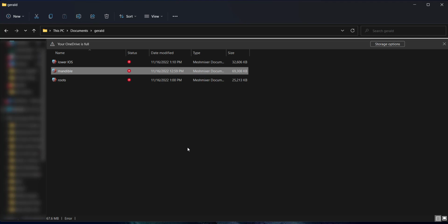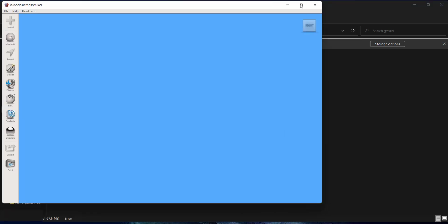This is really a video dedicated to just Gerald, but I thought, heck, maybe someone will get something out of it. So the prerequisites for doing this, at least in the way I'm going to show you: you're going to need an intraoral scan of the patient. Obviously, you need a CT scan of the patient. And what I've done is I've taken that CT scan and run it through DiagnaCat, which is an AI-driven bone segmentation process. As part of that process, it's going to segment the bone, so you'll get a mandible or a maxilla with its sockets, but you'll also get the roots of the teeth segmented. So for starters, I'm going to go ahead and open up this mandible, but those are really the three pieces of data that we would need.